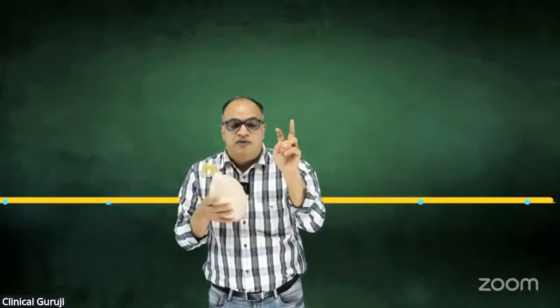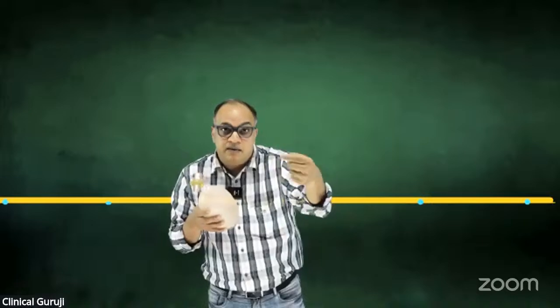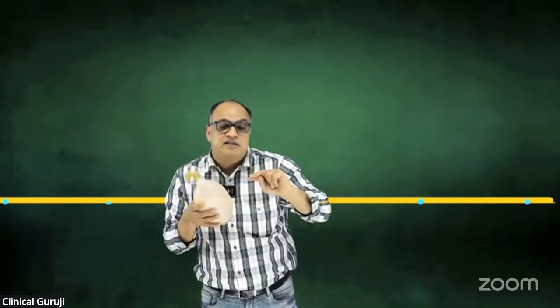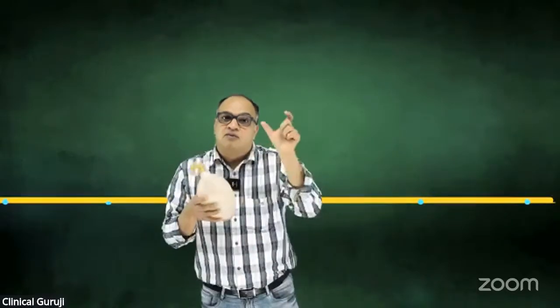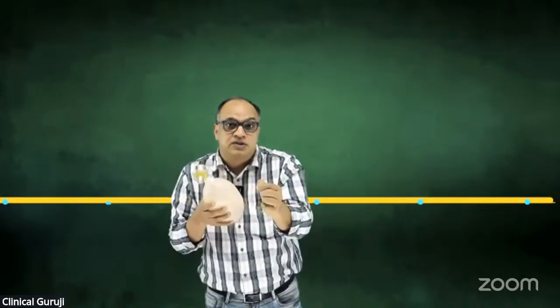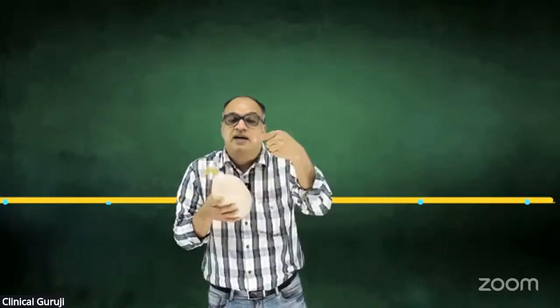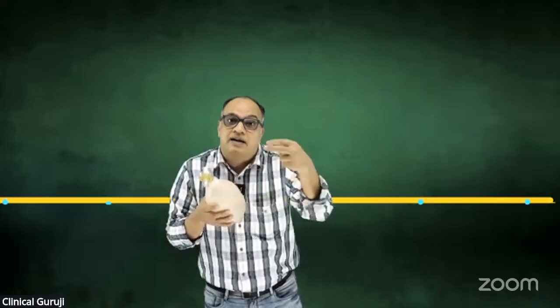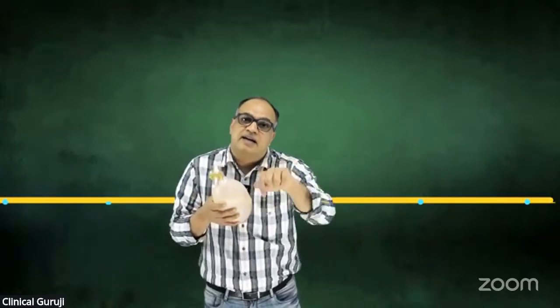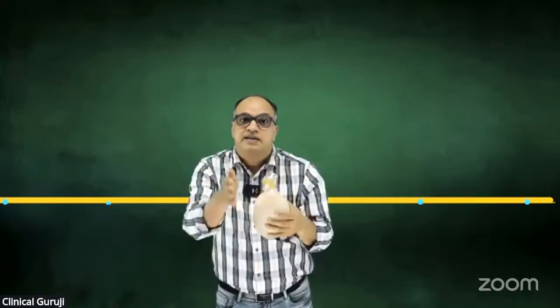Will it give 500 because the 5 seconds are finishing, or will it give 15 pressure support because it is a spontaneous breath? Since this breath is coming very close to the time of a mandatory breath, it will recognize the spontaneous breath and give 500 tidal volume. It will synchronize the mandatory breath with the patient's effort.